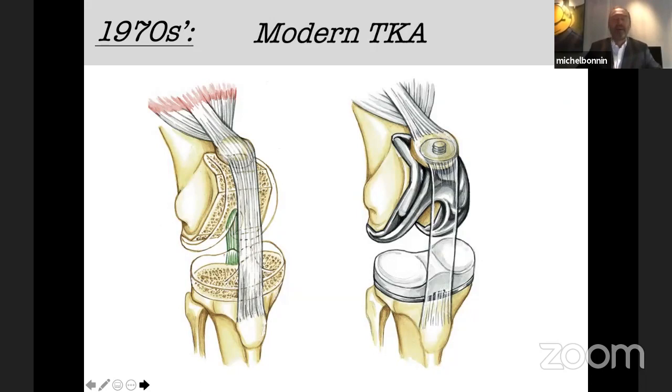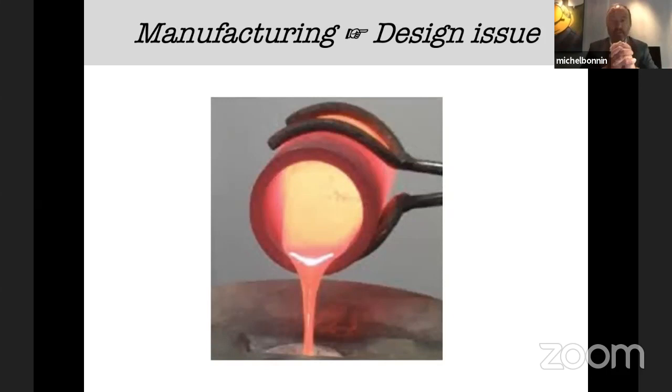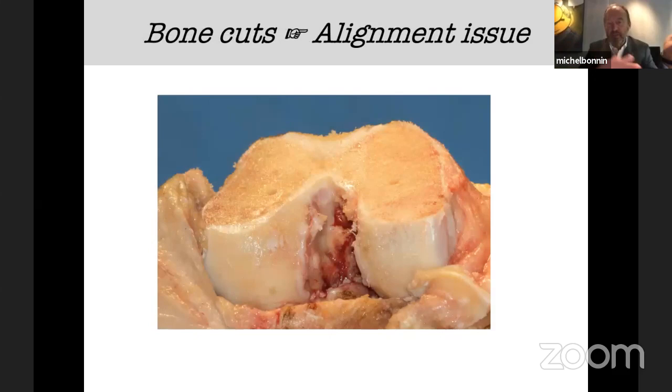There were two main breakthroughs. First, a technical breakthrough, because the implant required bone cuts with dedicated tools to do a reliable preparation of the bone. And also the design of the implant was definitely carved into the marble, with a fixed design. This has been tremendous progress, but there are some limitations. The first limitation was a manufacturing limitation, because it was a very hard metal. It was a cast, molded metal, and it requires molds, which are very expensive in the industry. So the manufacturers always try to limit the number of implants, and it has always created problems for surgeons. The second limitation is that, because it was based on bone cuts, it influences the alignment, and we began to discover the problems due to a malaligned prosthesis.